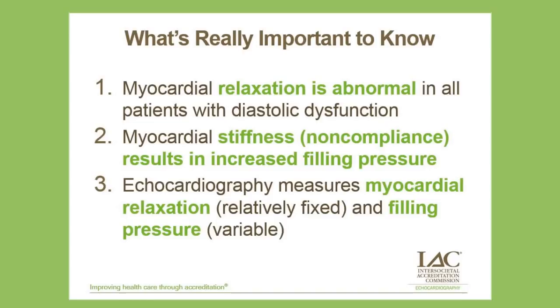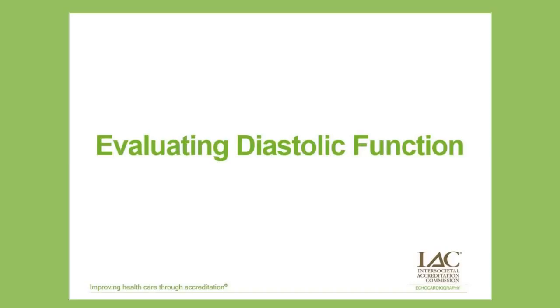The second thing that's really important to know is that myocardial stiffness or non-compliance results in increased filling pressure. And we'll talk about that a little bit more. The third thing is that echocardiography very handily measures both myocardial relaxation, which is something that's relatively fixed, and then filling pressure, which is something that's variable. And we'll go through the parameters that tell us that in just a moment.